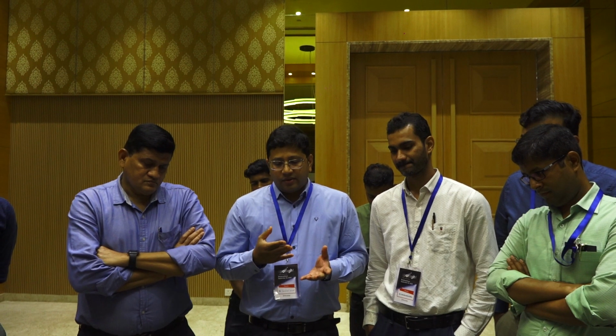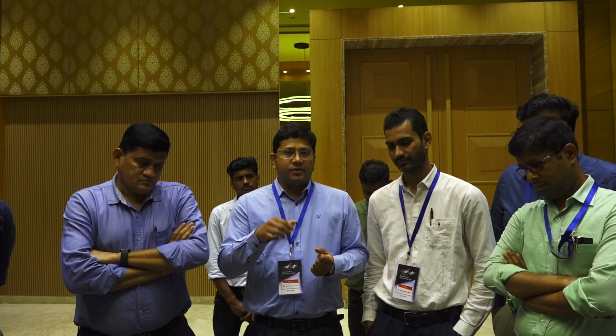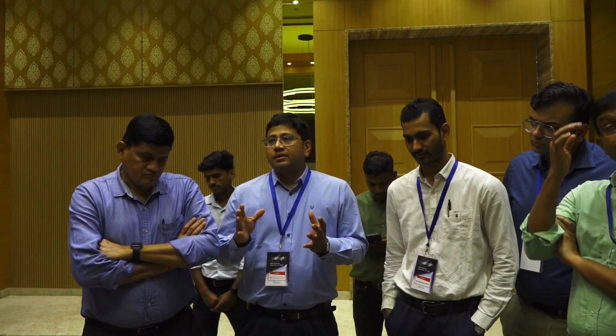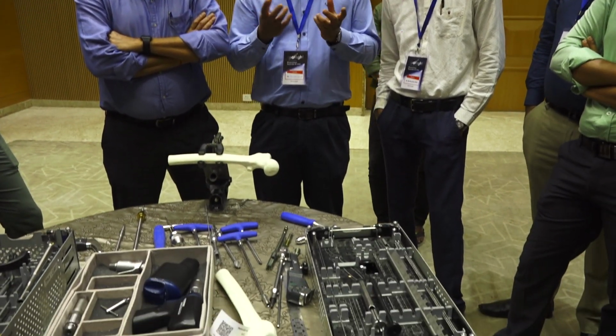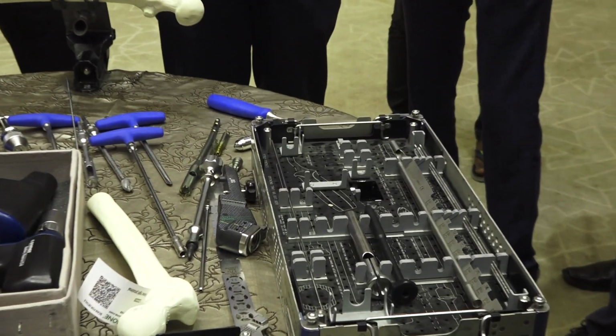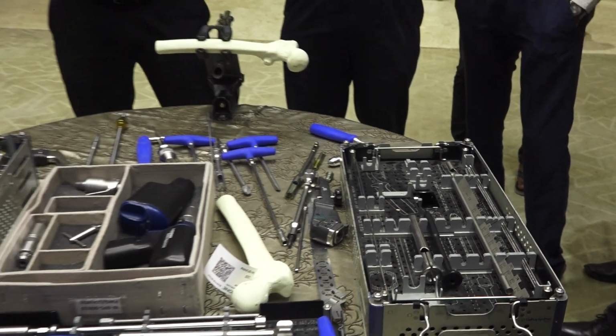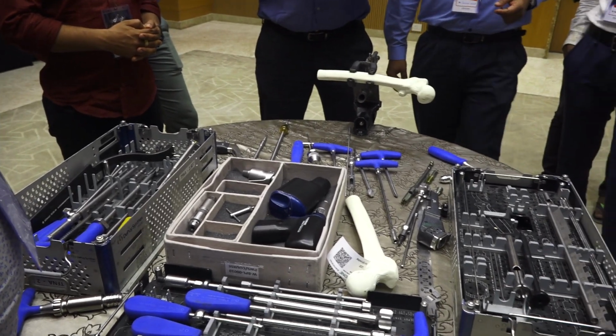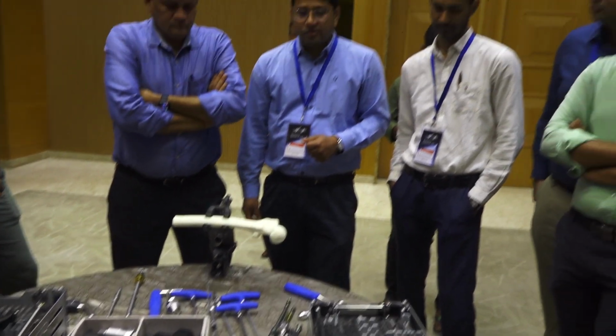Okay. So there are various ways of reduction, like we can use joysticks, spikes, bone hooks. Sometimes there is sagging, and we have to ask the assistant to lift up the sagging. And many times in a very unstable fracture, we have to provisionally fix the fracture with K-wires or some form of collinear clamps or forceps to maintain the reduction, and then we can start the process of nailing. So reduction is key to success.